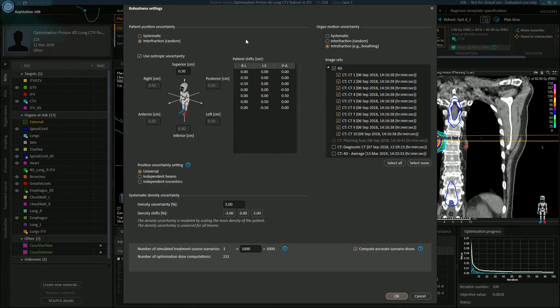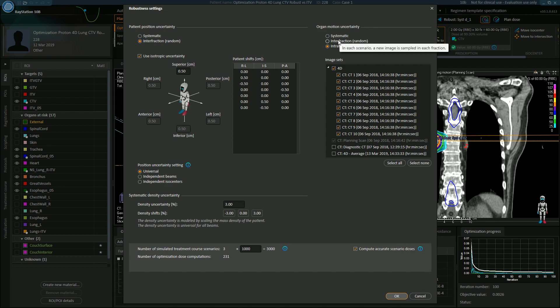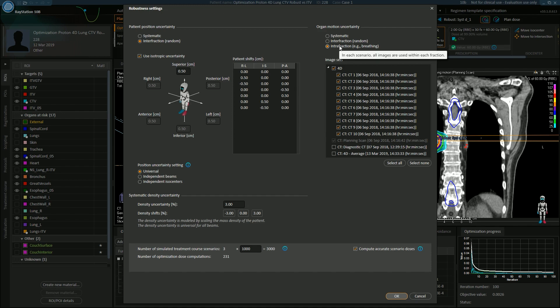Let's take another look at our robust optimization settings now that we have a 4D scan. We still have our patient position uncertainty and the systematic density uncertainty, but we also have an organ motion uncertainty. There are three options: systematic — the same organ motion for every single fraction; interfraction — the organ motion is different in every fraction; or intrafraction — in each scenario, all images are used within each fraction. This is perfect for the current problem where we are trying to take into account the breathing cycle, with the tumor constantly moving and changing density. I've chosen to use all of the scans in the 4D dataset.